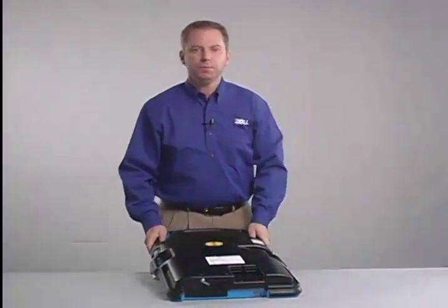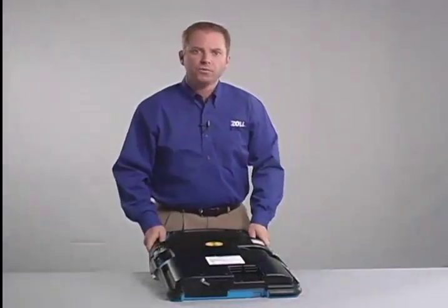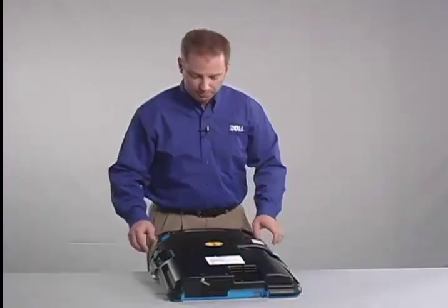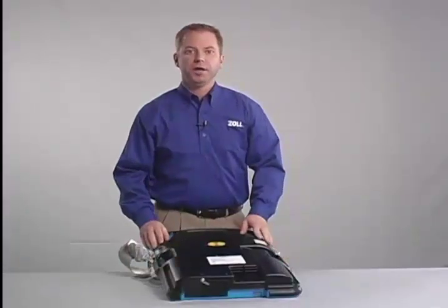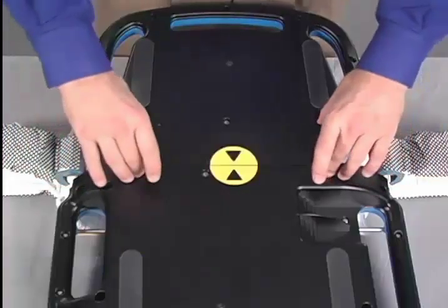Lift up on the blue plastic band guards found where the lifeband meets the sides of the Autopulse platform. Remove the cover plate by pinching the four tabs and lifting up.